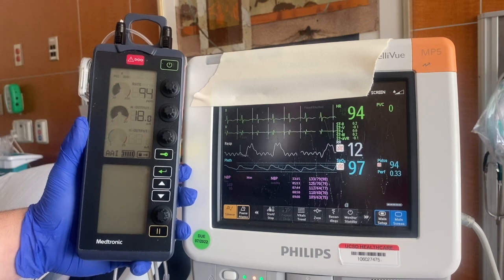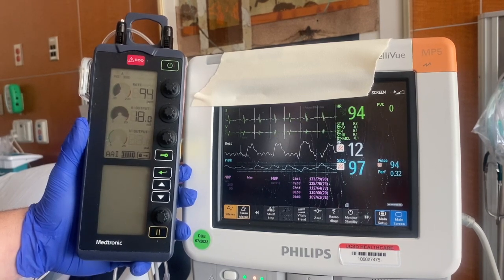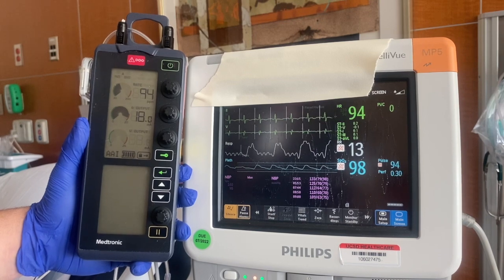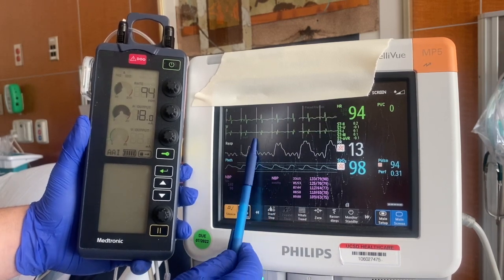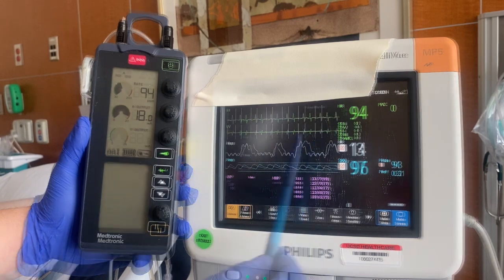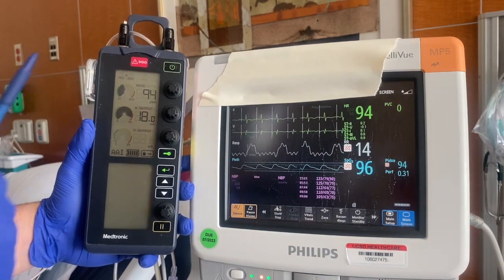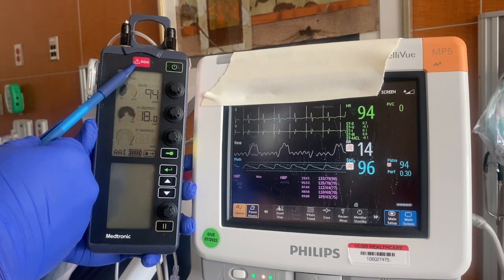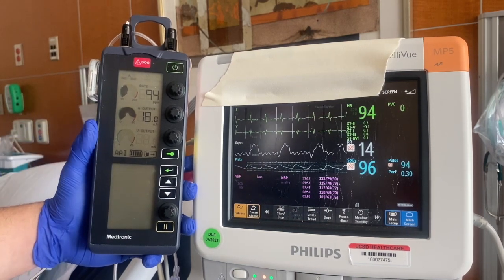We know that the pacing spike occurs before the P wave at every beat. One thing to highlight from the start is that there is an emergency button up top — it's the red button — in case you need to use it to emergently pace.